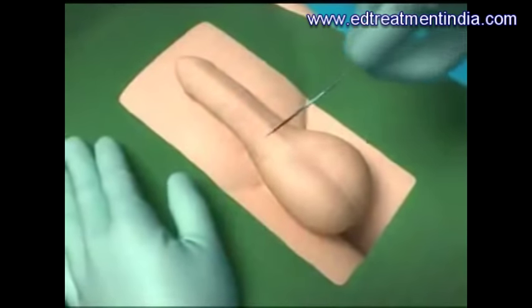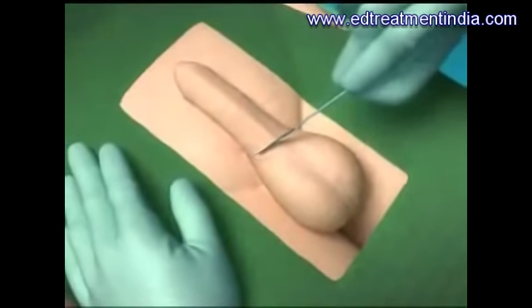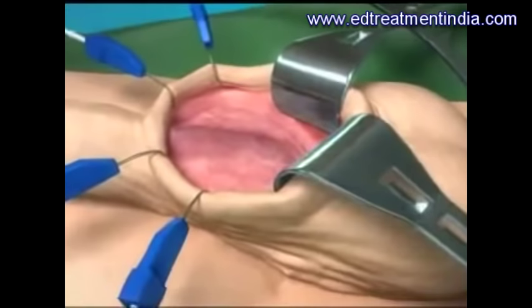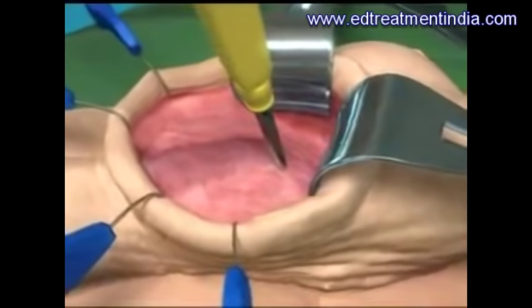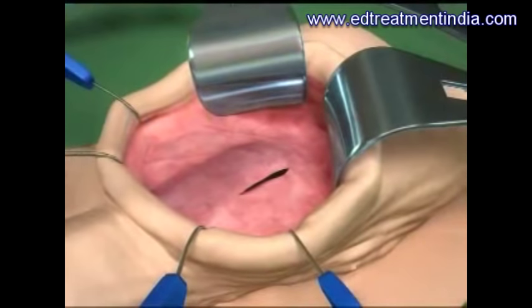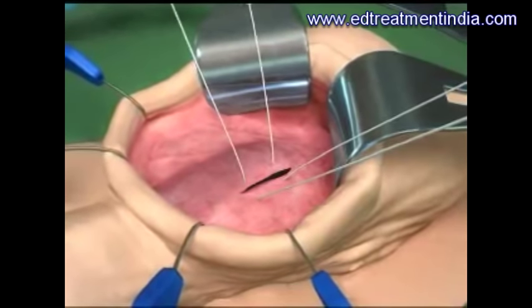An incision is made where the penis and scrotum join. An opening into one of the erection chambers is made and sutures are placed.